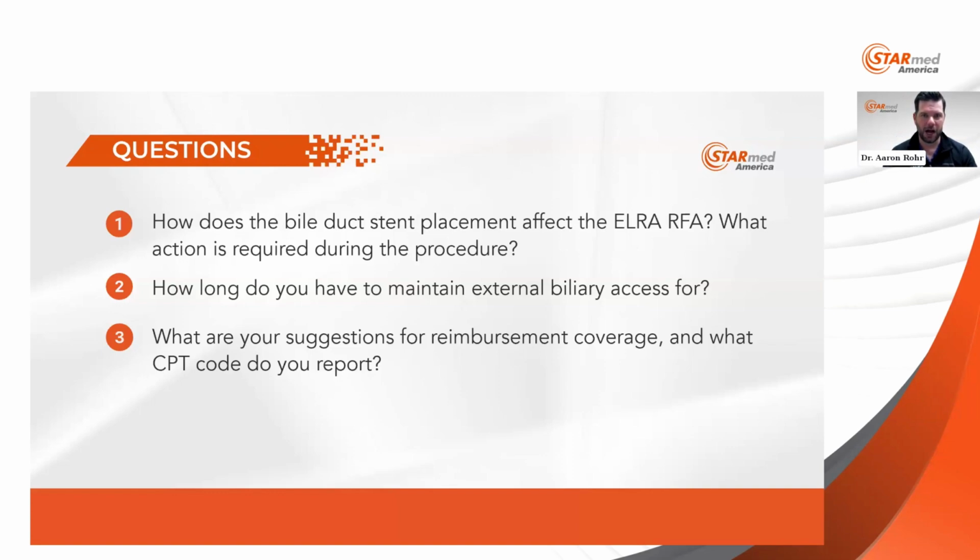So the first one here is complications seen in patients, whether it's immediate or long-term. Okay, I'll do the first one. We'll do one by one. So the complications seen in patients, this was a very tenuous and arduous task for me initially, getting comfortable with the system, because in the back of my mind, everything was, am I going to compromise the anastomosis or the bowel? I did not want this advanced into the bowel at risk of, even during peristalsis, whatever it may be, zapping that too badly, requiring surgery. Obviously, they just had a surgery. I want to stay away from that as much as possible.